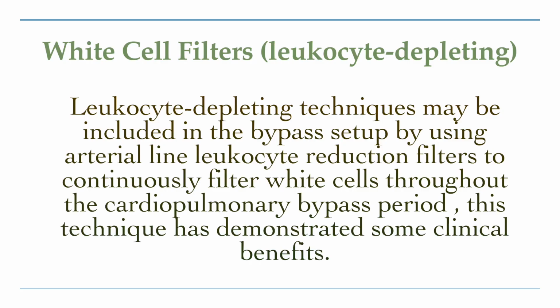White cell filters, leukocyte depleting. Leukocyte depleting technique may be included in the bypass setup by using arterial line leukocyte reduction filters to continuously filter white cells throughout the cardiopulmonary bypass period. This technique has demonstrated some clinical benefits.